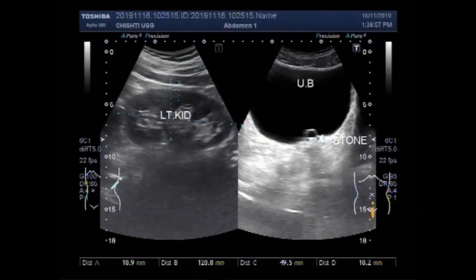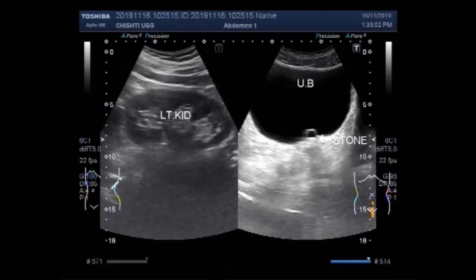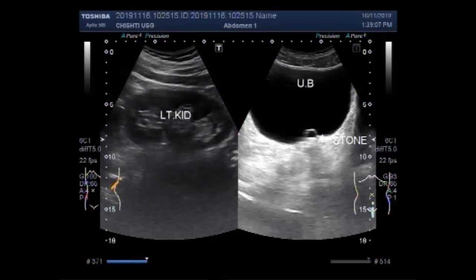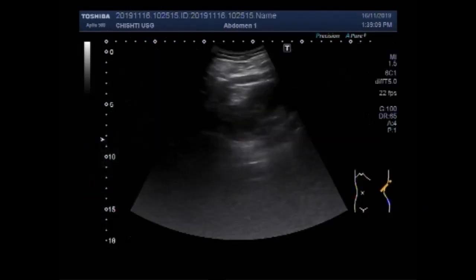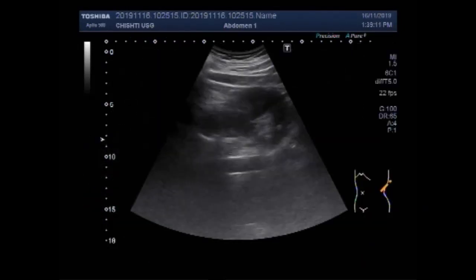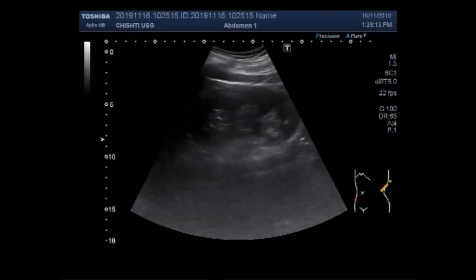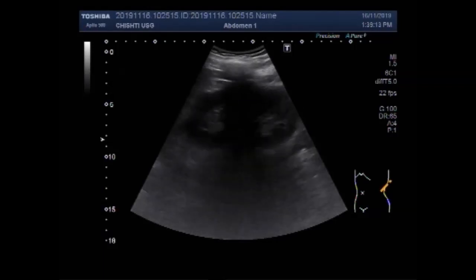Dear viewers, I hope you are all fine. This ultrasound video shows a ureterocele. You can see the left kidney.